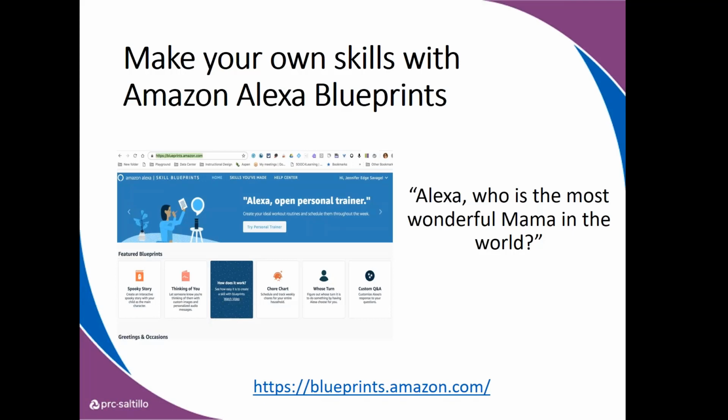Or you could put in flashcards, or maybe you're working on certain core words, or you're working on social skills, whatever it might be that your AAC user is working on. If you can type in, here's what I want my child to say, and this is what I want Alexa to say back, you can go to blueprints.amazon.com, log in, start a new question and answer skill, and have total control of what Alexa's going to say back to you.